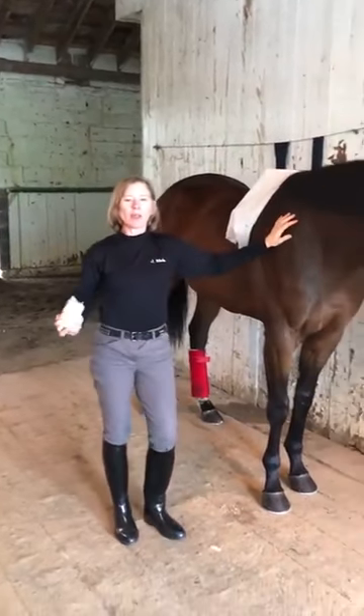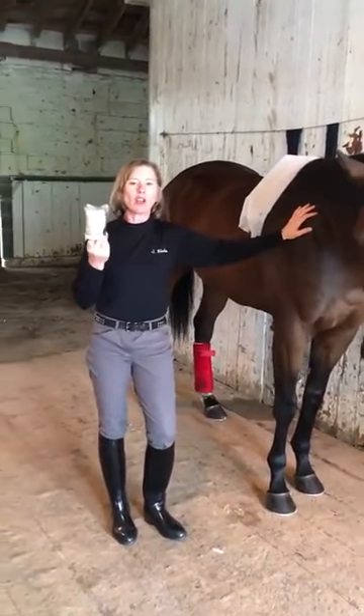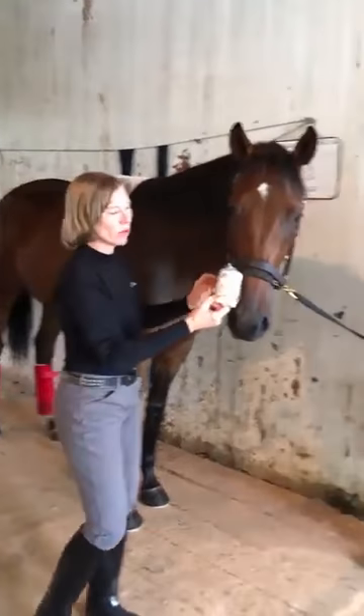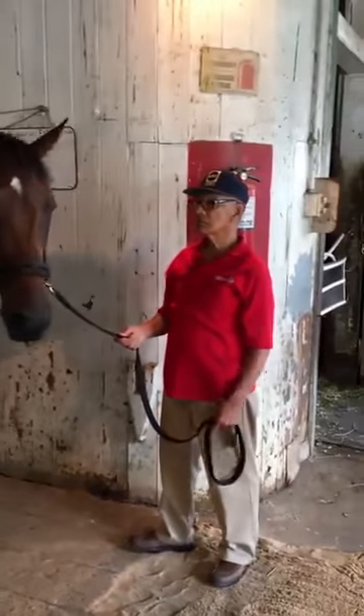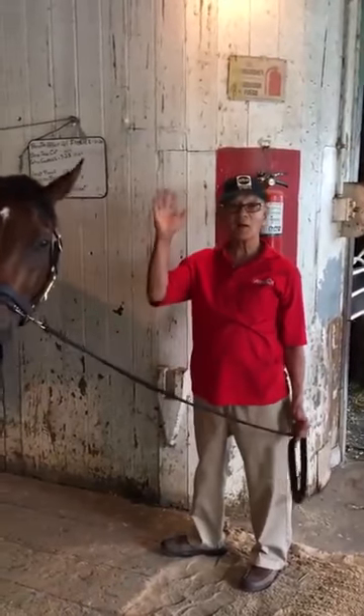Hi, this is Janice L. Blake here, and today I'm going to show you how to properly wrap a horse's leg with a vet wrap. We have someone here of note holding the horse — this is Braulio Baeza, Hall of Fame jockey. Say hello, Braulio. Hello.